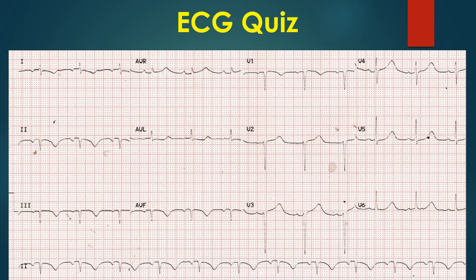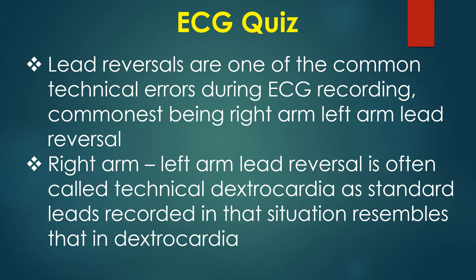Sometimes one may have a doubt whether it is a transient supraventricular rhythm abnormality. But QRS abnormalities reverting back to normal rules out that possibility. Lead reversals are one of the common technical errors during ECG recording. The most common being right arm–left arm lead reversal, often called technical dextrocardia, as standard leads recorded in that situation resemble those in dextrocardia. Chest leads will not be altered in that case, which clinches the technical error.